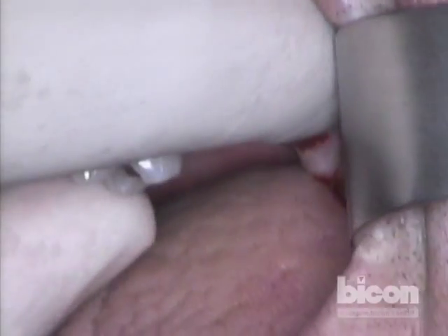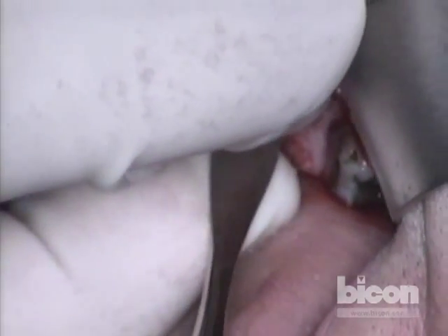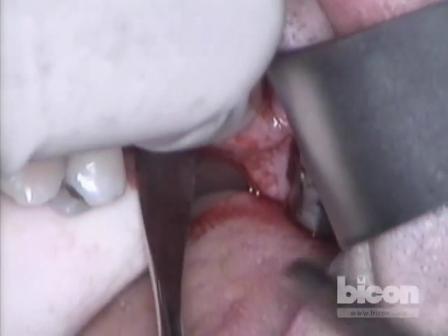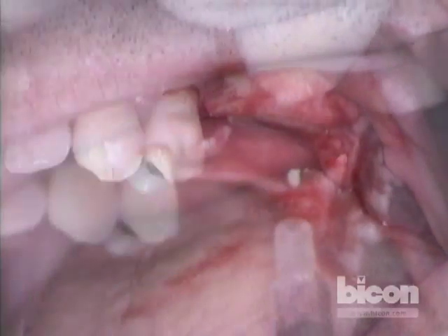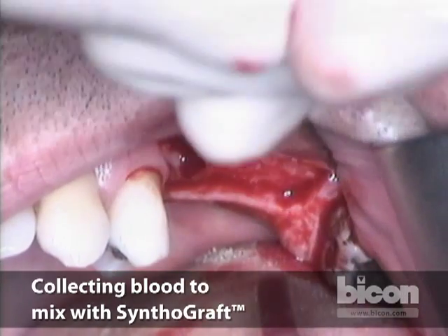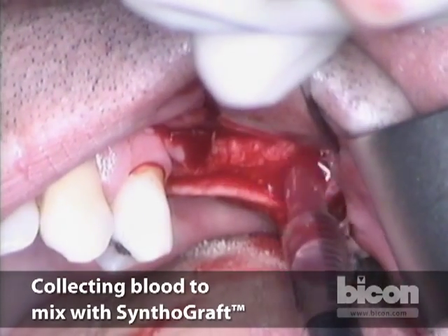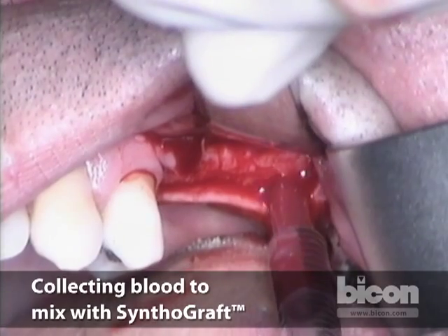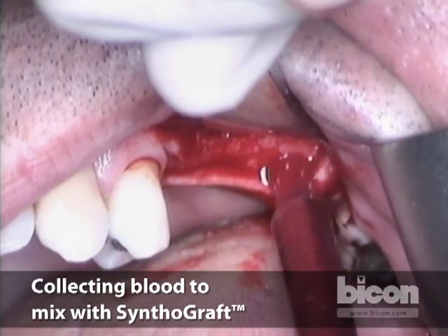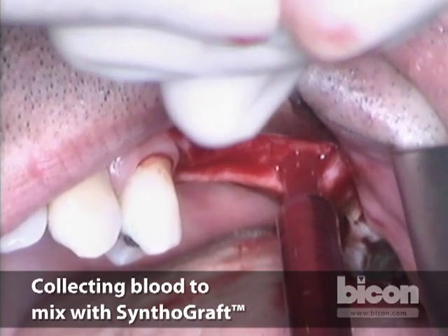To lift this flap, the best way is using your thumb as a pivot and your index as a protector so we don't over-dissect. We'll quickly elevate the area. Because we are planning grafting in the form of a sinus lift, we will collect some of this liquid and use it to moisten our graft particles. We intend to use synthetic beta-tricalcium phosphate — synthograft — the purest form of beta-tricalcium phosphate available to us.